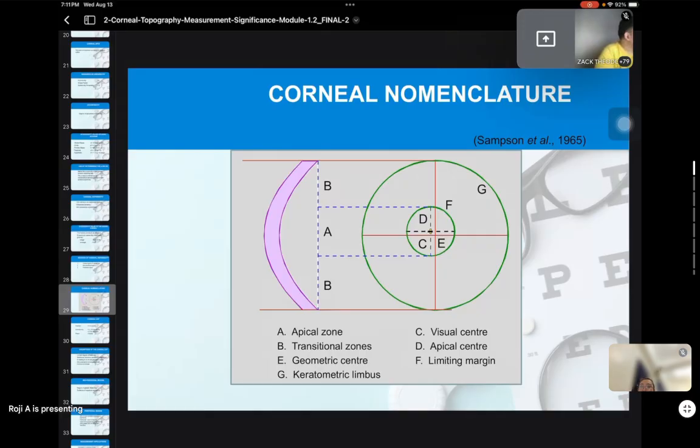All right, guys. Can someone explain apical zone? So that's the center. Transition zone. What does it mean? As I've said, if there's a junction, there must be a transition. When you say transition, I'm transitioning from earlier work now to homework, right?